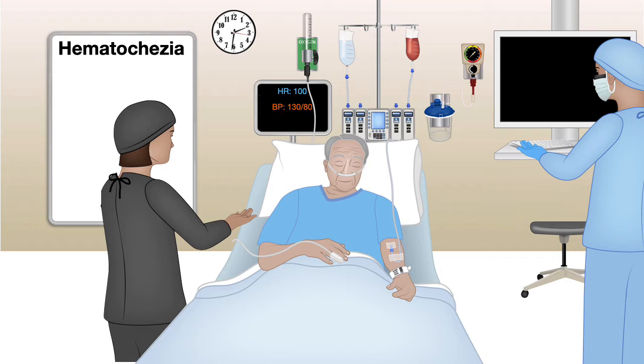So the first thing is to make sure that the patient has become hemodynamically stable and the hemoglobin is in good shape and has been cleared by cardiologists or other subspecialists if the patient has serious comorbid conditions. And once the patient is ready for the procedure, we place an order for colonoscopy.